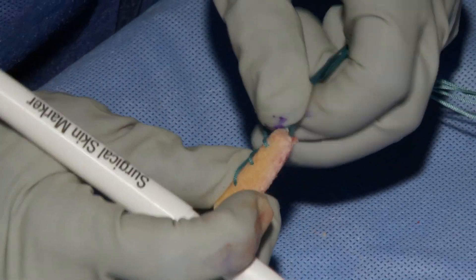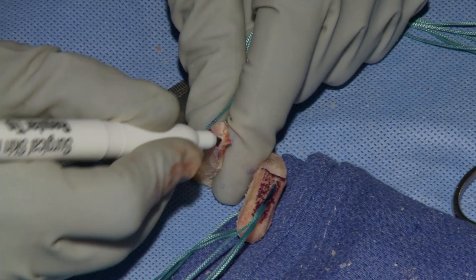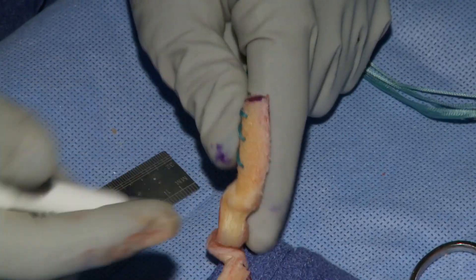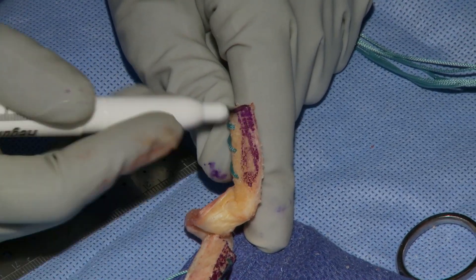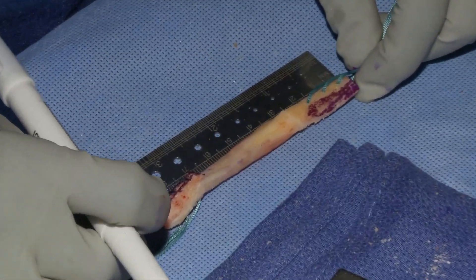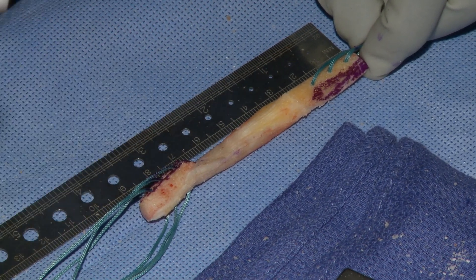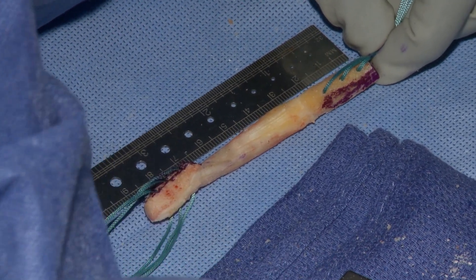Before you start prepping the graft, check with the surgeon to see what dimensions he wants for each bone plug. Typically we do a 10mm diameter in both the tibia and the femur. The length is usually 20mm, unless the patient is very short — then sometimes we'll use an 18mm bone plug in the femur.